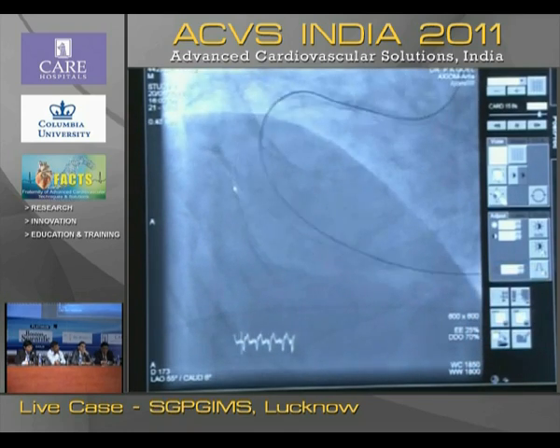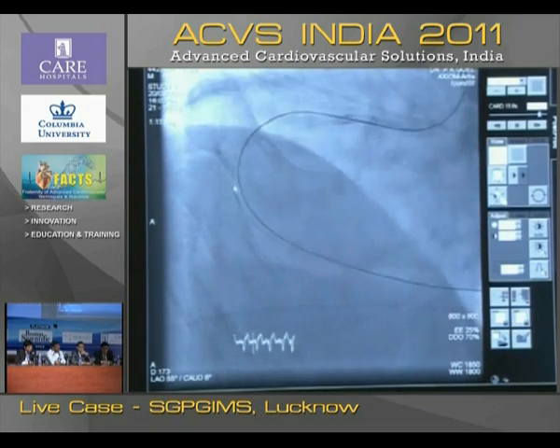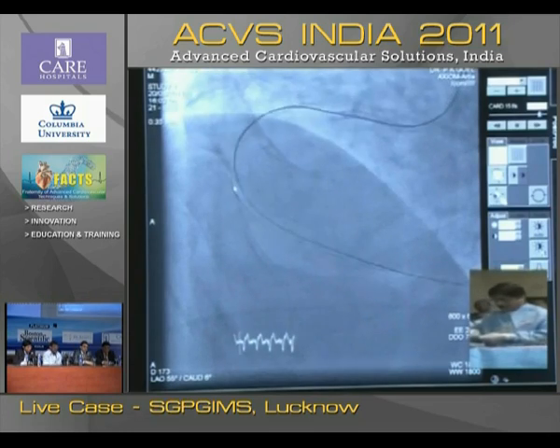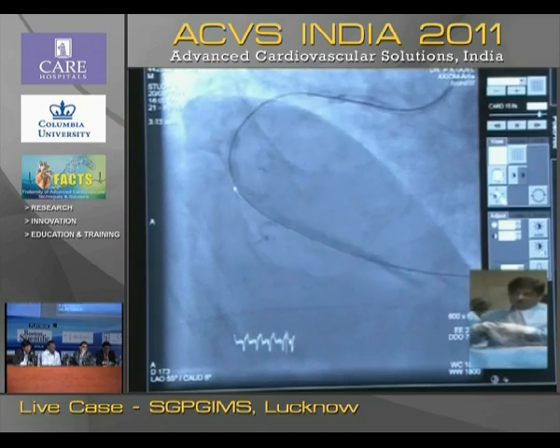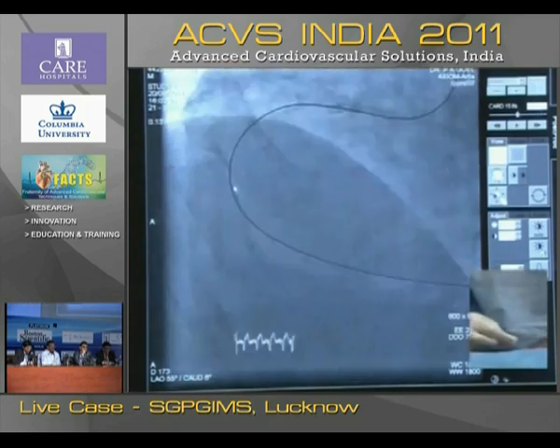You see, because we're doing live, so I'm using all new balloons. In my regular practice, I might not have done that. Otherwise I would have maybe used Oxford balloon or things like that. No, we thought yours is a rich hospital. Once you have crossed it, the first crossing is difficult. Well, yeah, we can afford this thing.